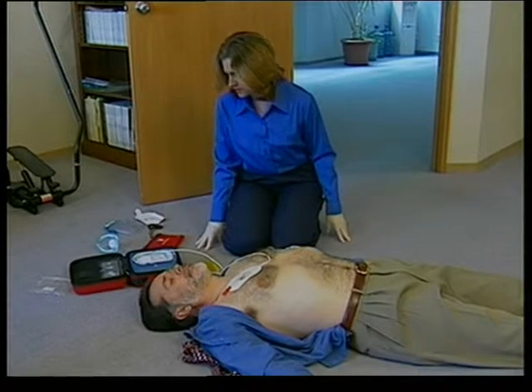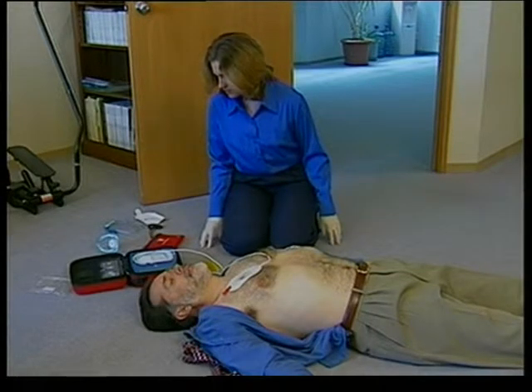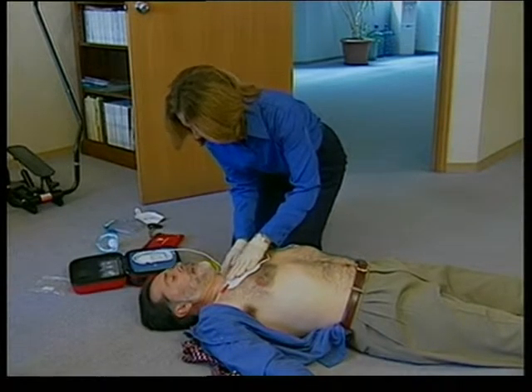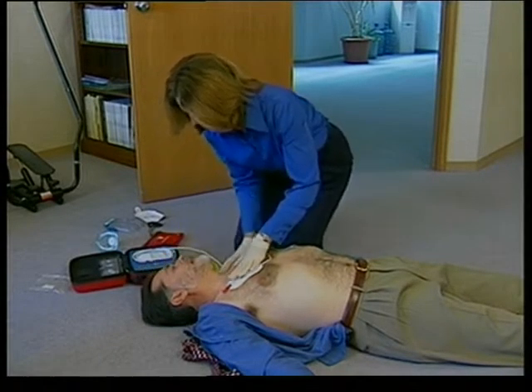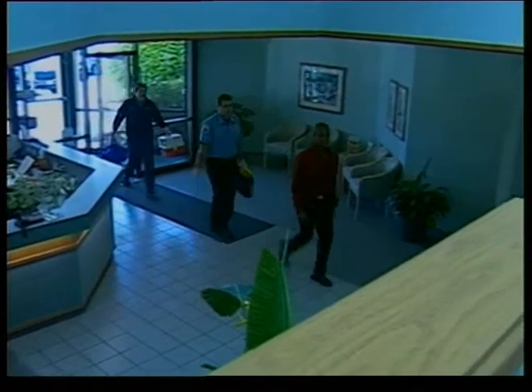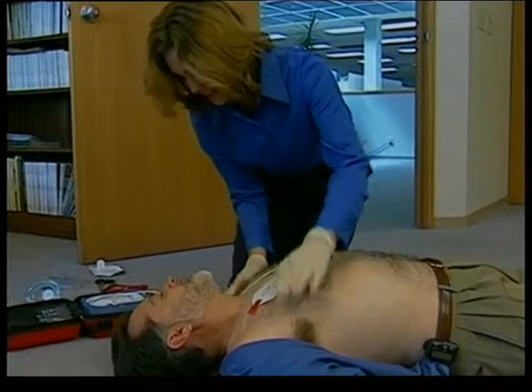After delivering the shock, the defibrillator immediately reanalyzes the heart rhythm. Do not touch the patient until the defibrillator tells you it is safe. It will advise you if any additional shocks are necessary. If no shock is advised after rhythm analysis or upon completion of a shock series, the HeartStart will remind you to call emergency medical services in case you have not yet done so, and then instruct you to assess the patient and begin CPR if needed.